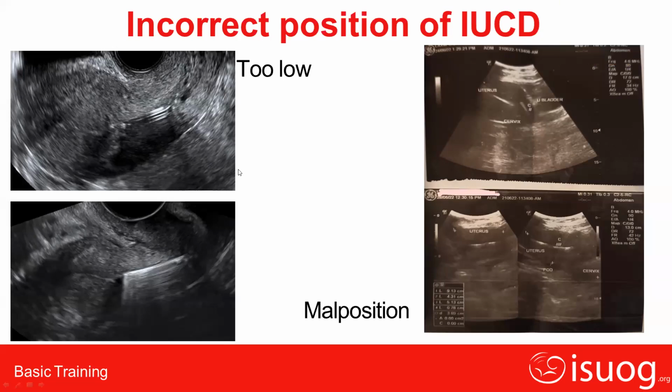Yes, so this also happens. I had also seen one in the cornu of the uterus, where the IUCD had perforated and extruded. The machine had detected it, and laparoscopically we saw the omentum was adherent to the cornu, we just dissected it out and removed that displaced IUCD laparoscopically. That's why I always tell all gynecologists should learn ultrasound. Both.